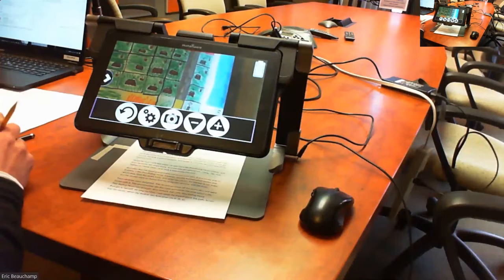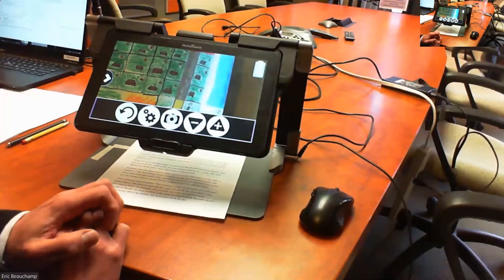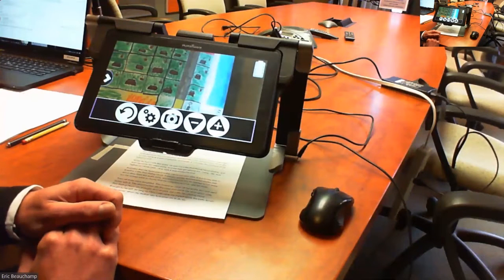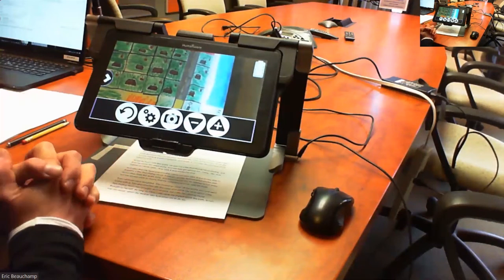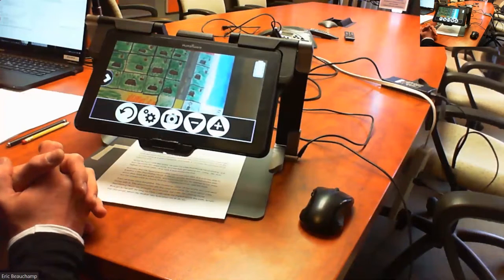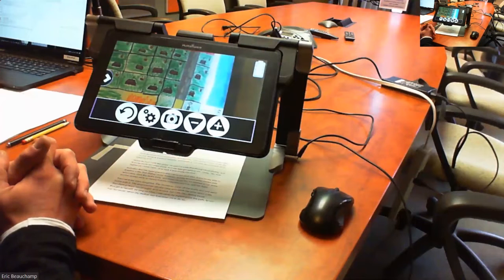Good question. Okay, so when you're using the distance camera all the time, it will last about maximum 3.5 hours. It's not a big battery on there, but there's something coming in the next version. We'll see what we can do to optimize that battery life. But you can purchase some more batteries through the school and have one on charge while using the other one, and once the battery's dead, you can swap the battery. That can be done. I saw it in several schools where they have several batteries and one's charging while the other one is being used.